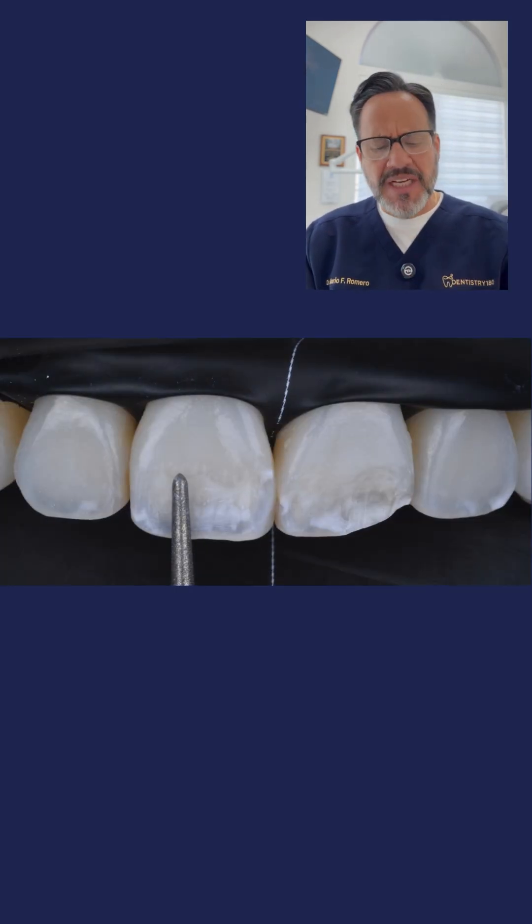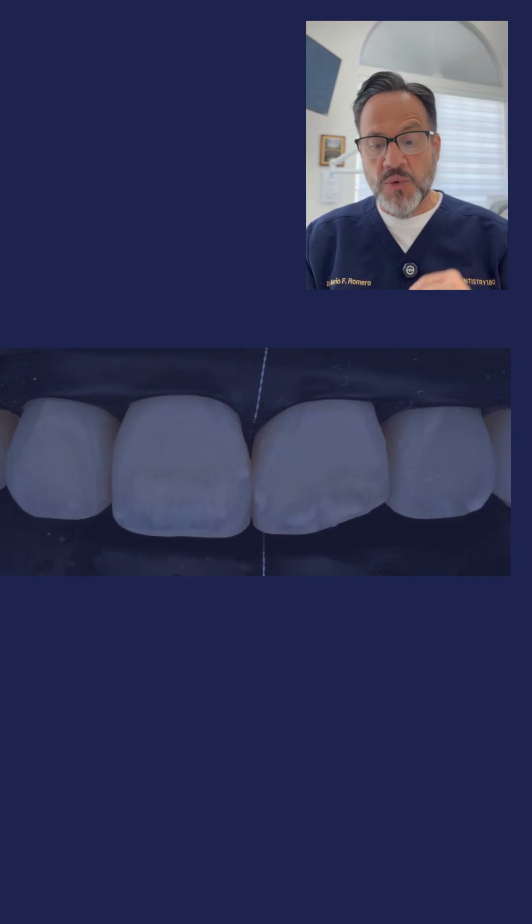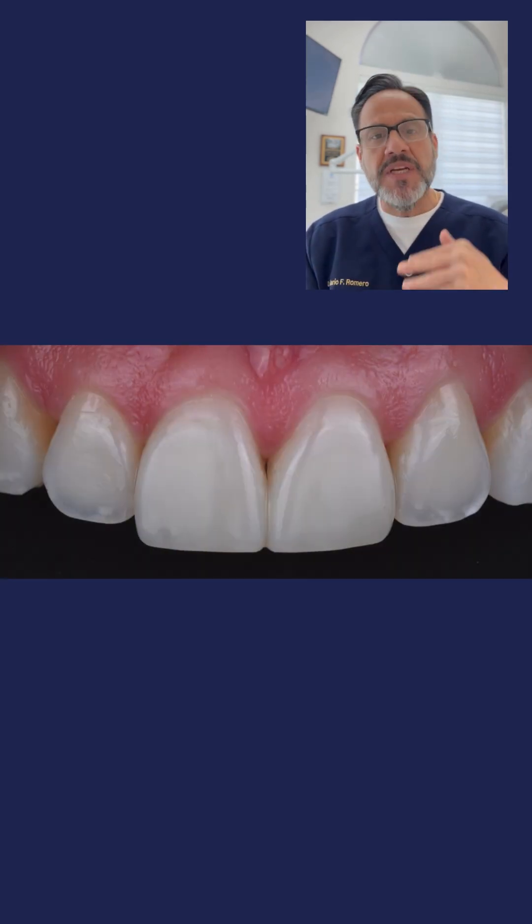On photo number seven, we're polishing the entire surface. On photo number eight, we're ready to restore.